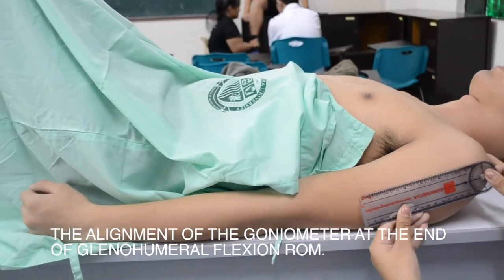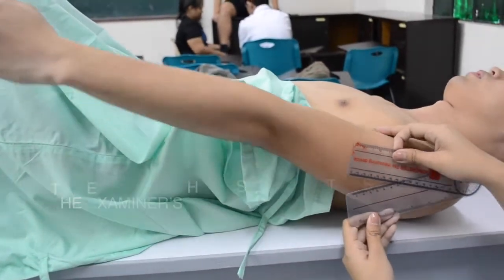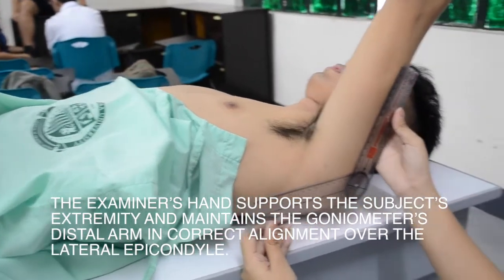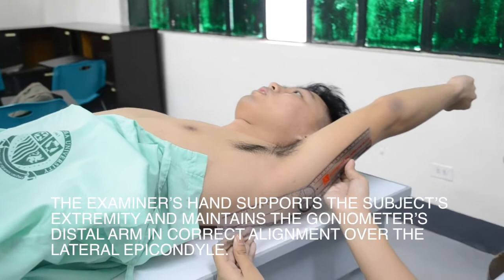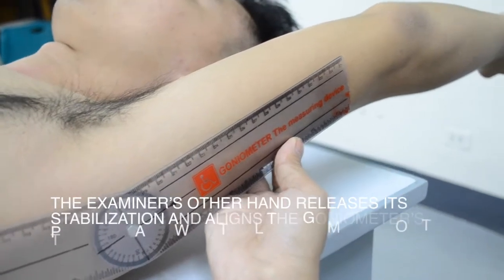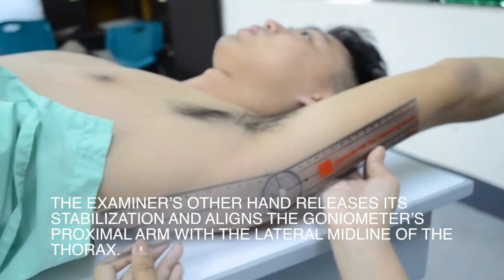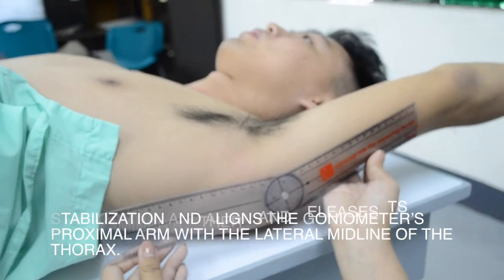The alignment of the goniometer at the end of glenohumeral flexion ROM. The examiner's hand supports the subject's extremity and maintains the goniometer's distal arm in correct alignment over the lateral epicondyle. The examiner's other hand releases its stabilization and aligns the goniometer's proximal arm with the lateral midline of the thorax.